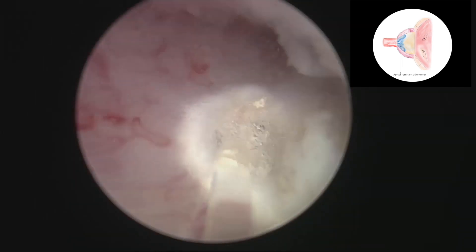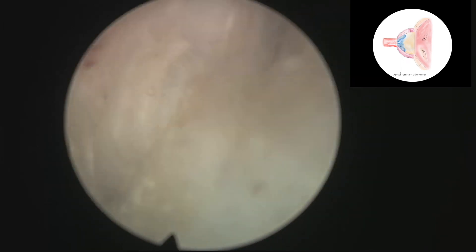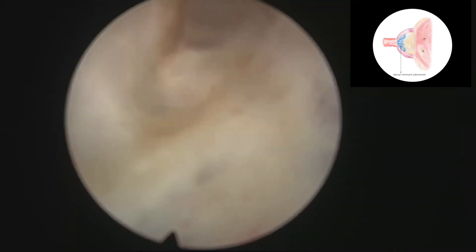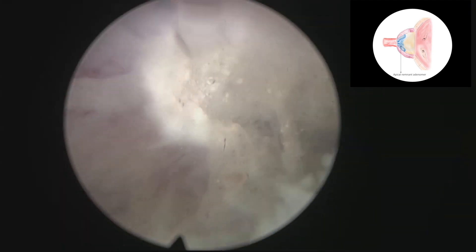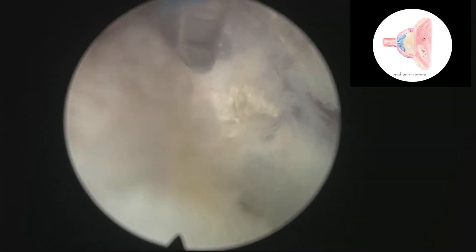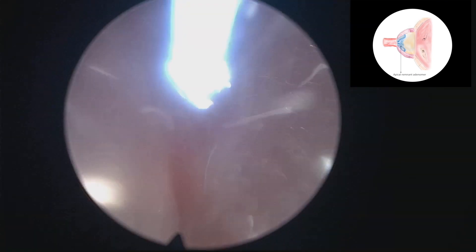This is a relatively fast and easy operation, and as we mentioned before it's important to try to get all the way down to the capsule. In this case after two TURPs it looked as if there was not much tissue left, but one has to try to go all the way to the capsule and remove all the remaining adenomatous tissue. That's the crista urethralis over the verumontanum, and it is possible to see that there's still some tissue left. It would be very unfortunate to perform a re-treatment and leave residual adenomatous tissue that could cause problems again.